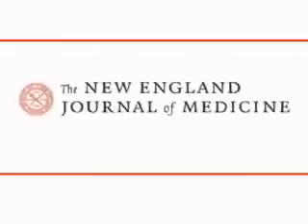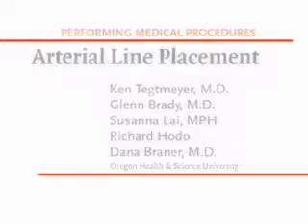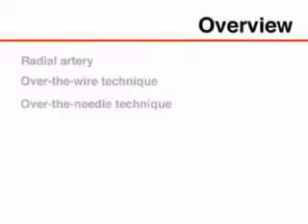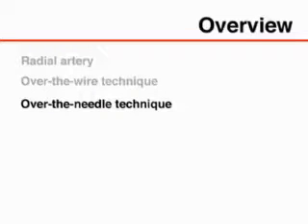This is a video in clinical medicine from the New England Journal of Medicine. This video will demonstrate arterial line placement in the radial artery using two of the many techniques available for arterial line placement: an over-the-wire technique and an over-the-needle technique.